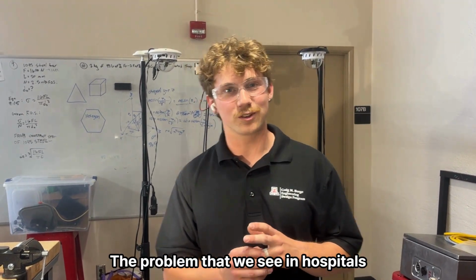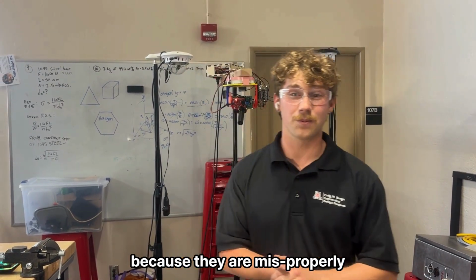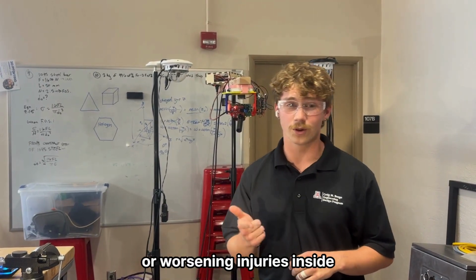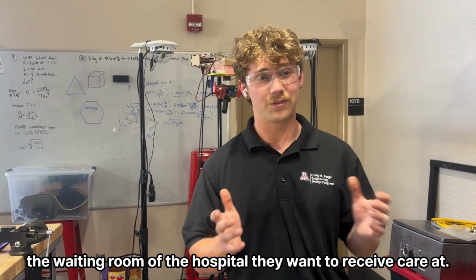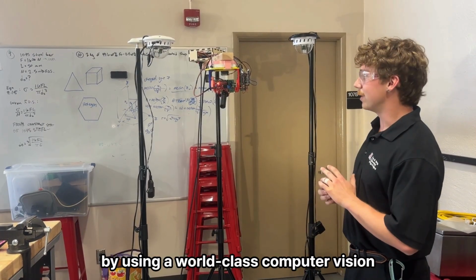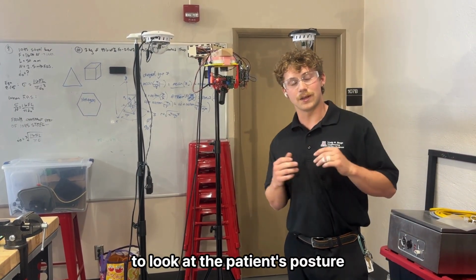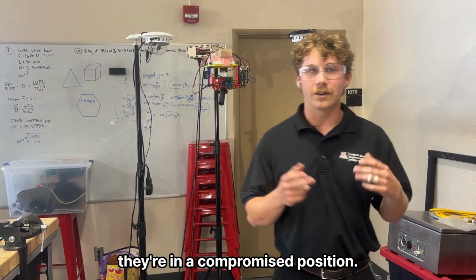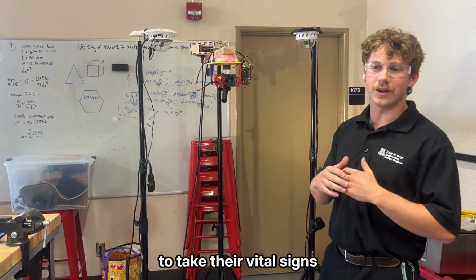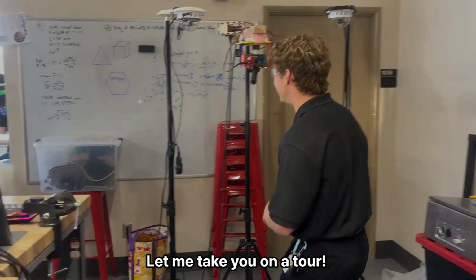The problem that we see in hospitals across the country is patients not receiving care in time because they are improperly diagnosed inside of their care facility, potentially having fatalities or worsening injuries inside the waiting room of the hospital they want to receive care at. Our system aims to address this issue by using a world-class computer vision and machine learning algorithm to look at the patient's posture and assess whether they're in a compromised position. Following that, we use our aimable radar system to take their vital signs and alert emergency responders if we see fit. Let me take you on a tour.